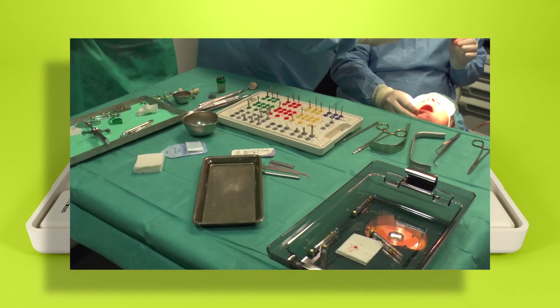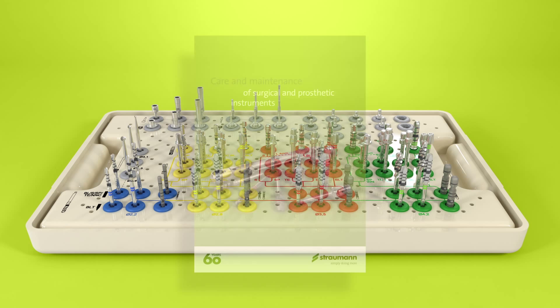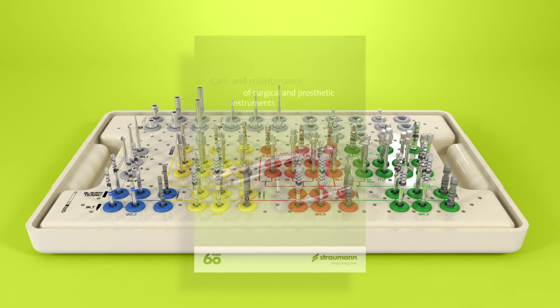After surgery, residues of blood, saliva, tissue or bone must be removed from the instruments and drills immediately. For cleaning the drills by ultrasound, the Straumann ultrasonic cleaning cassette can be used. The ratchet must be disassembled for sterilization and storage. The brochure, care and maintenance of surgical and prosthetic instruments, contains more detailed information.